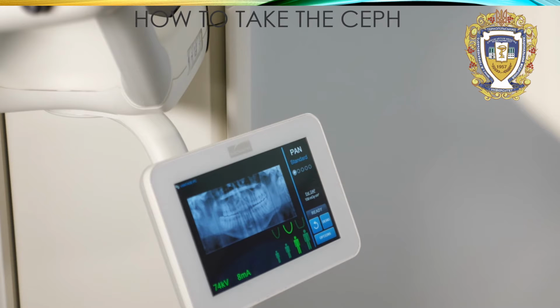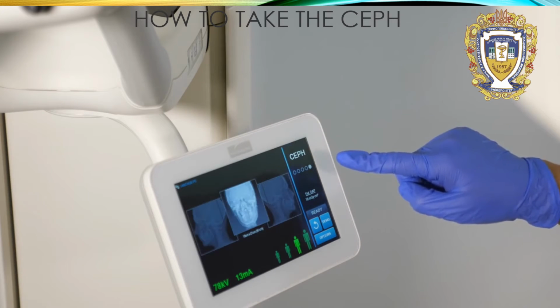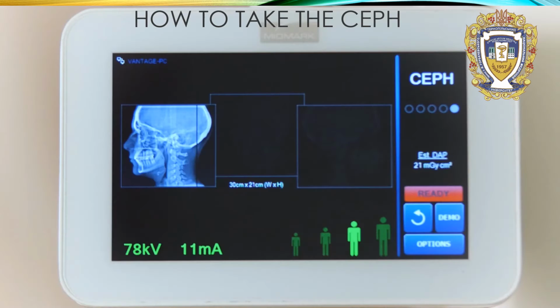To begin, tap the projection button on the top right of the Vantage Touch control screen to select the Ceph function. Verify the technique factors according to patient size and anatomy.